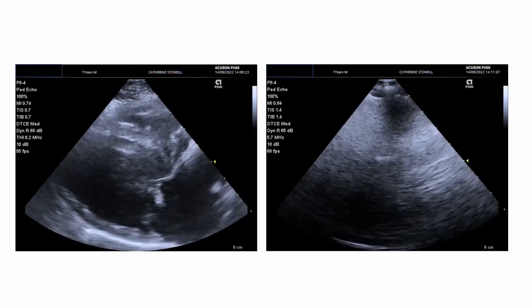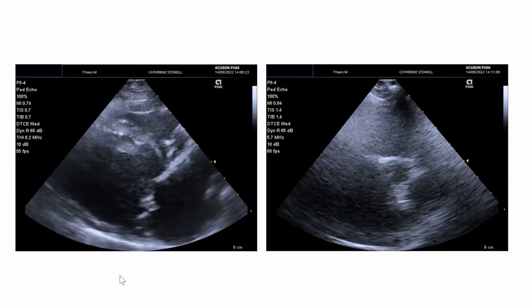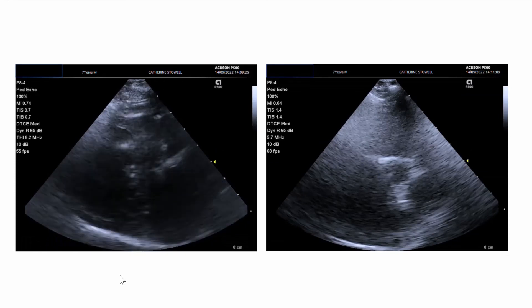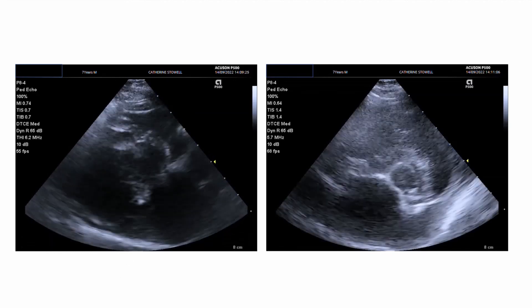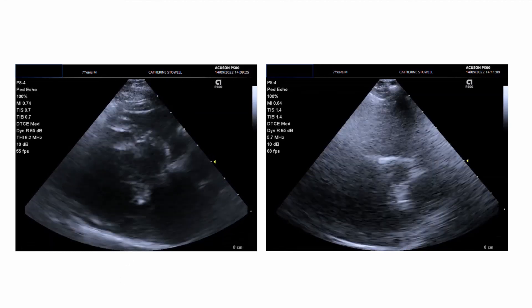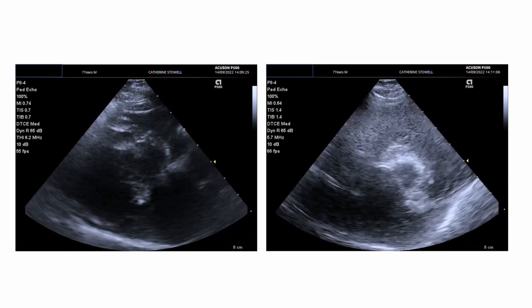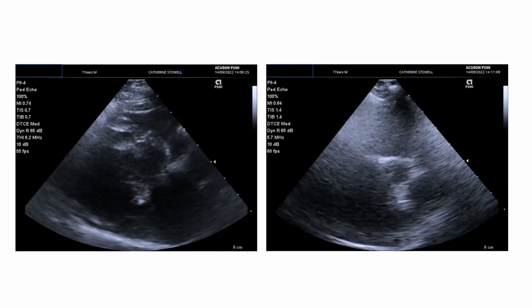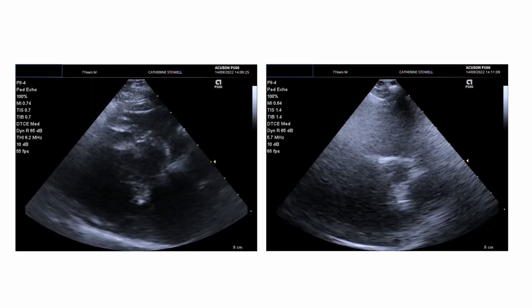This dog also has mitral valve disease, but the difference here is that cardiac remodeling has clearly occurred. Can you see how large this left atrium is? In the short axis, it's a really very dramatic dilatation — compare it to the aorta. You don't need an LAAO ratio to tell you that. So because cardiac remodeling has clearly occurred, combined with all your other examinations, you're more likely to find that this dog is going to be a stage B2.